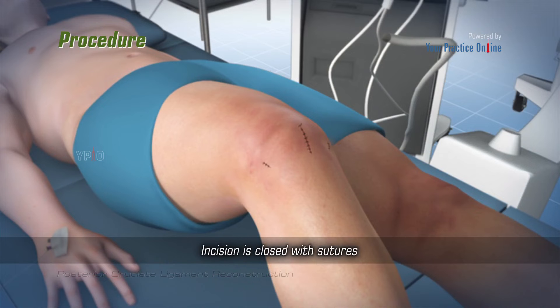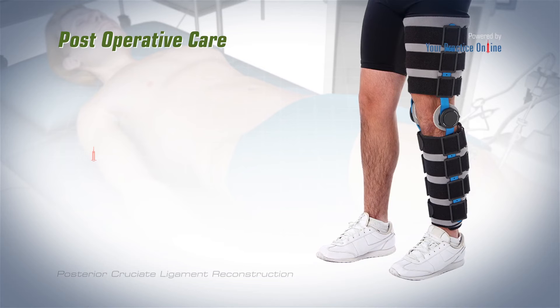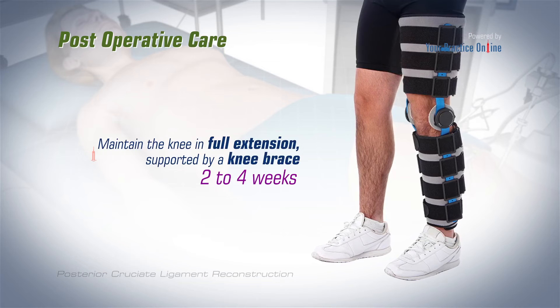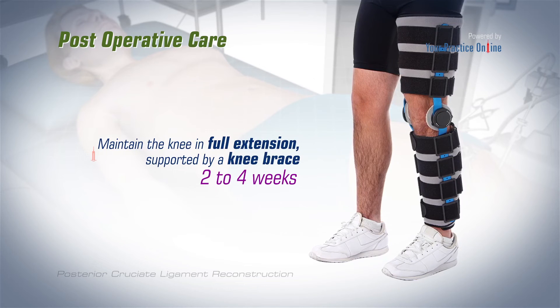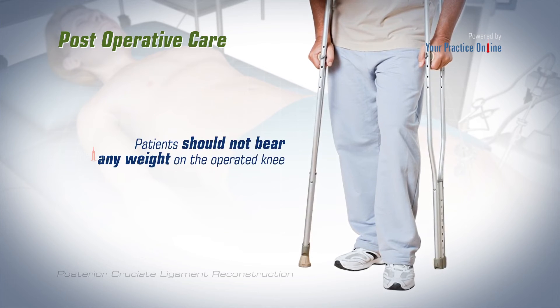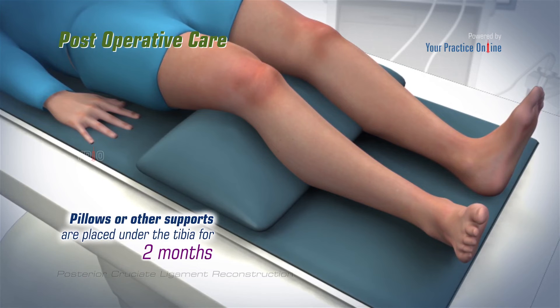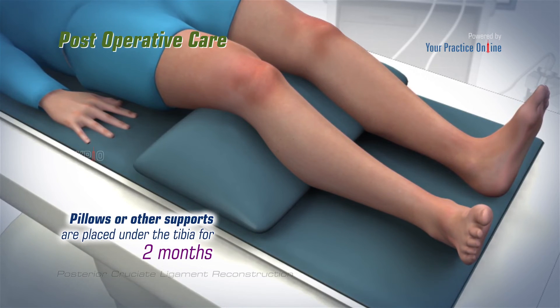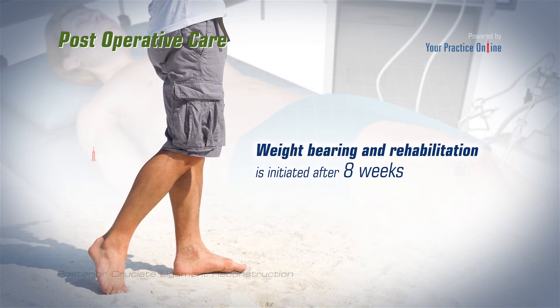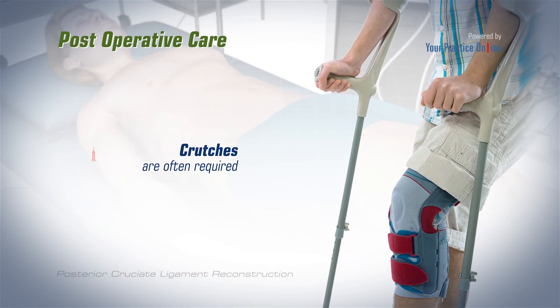After fixation, normal posterior stability of the knee is assessed by employing the posterior drawer test. The incision is closed with sutures and covered with sterile dressings. Post-operative care: Patients are advised to maintain the knee in full extension supported by a knee brace for a period of two to four weeks. Patients should not bear any weight on the operated knee. Pillows or other supports are placed under the tibia for the first two months after surgery to prevent any posterior subluxation of the tibia. Weight bearing and rehabilitation is initiated after eight weeks. Crutches are often required until normal strength is regained.